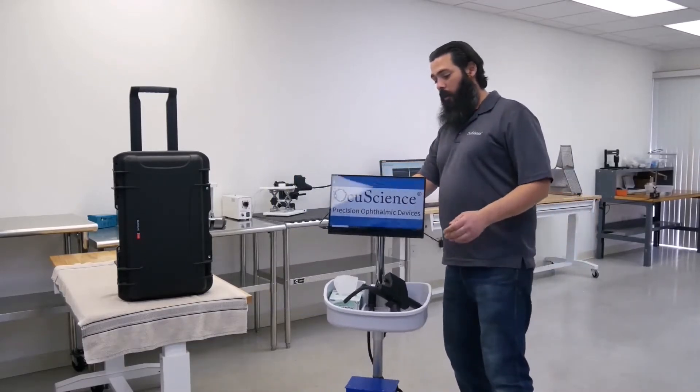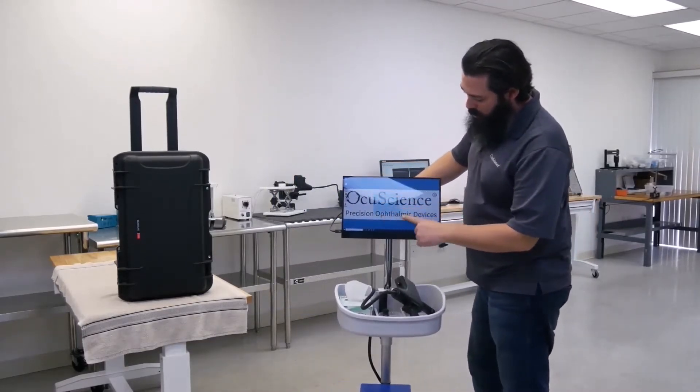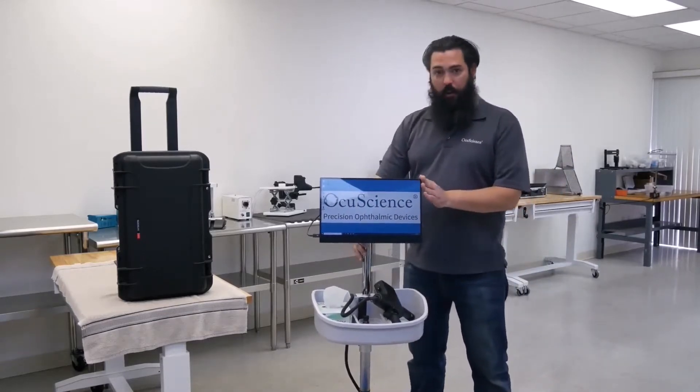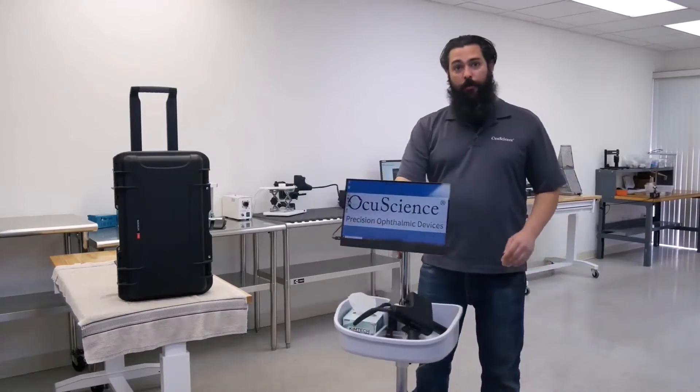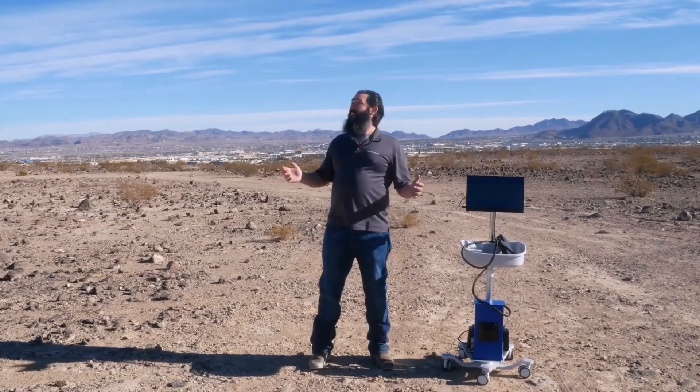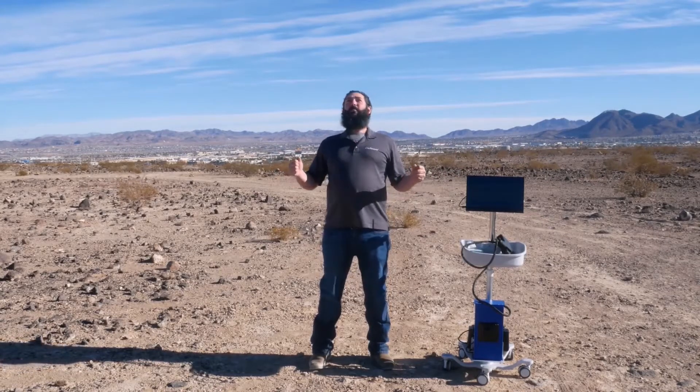Our mobile cart comes with a touchscreen monitor to allow for ease of use. Another wonderful thing about this cart is we're able to roll it from room to room or even outside — or inside. We're back inside.